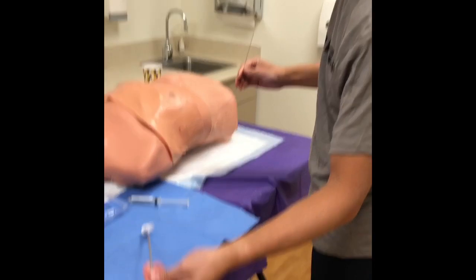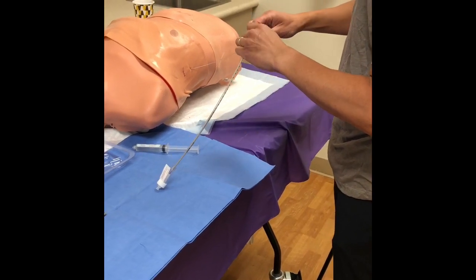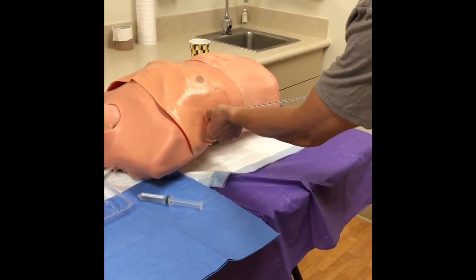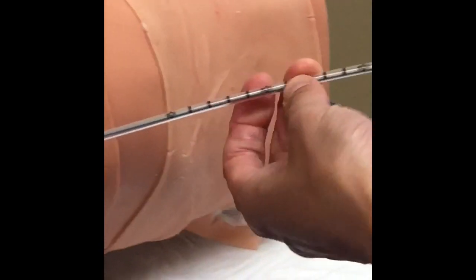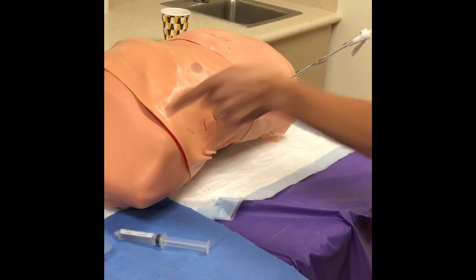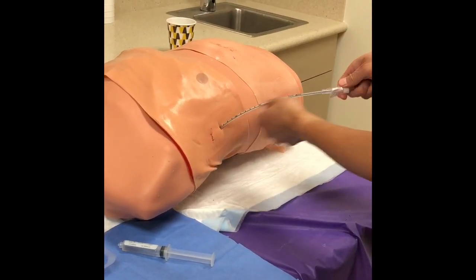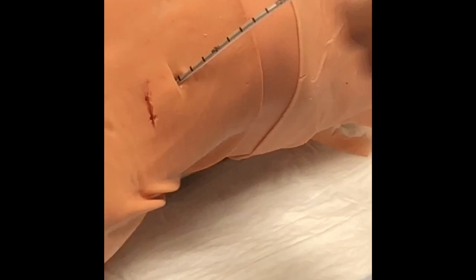This allows you to introduce the tube. This is a 14 French Cook catheter, which is fine for spontaneous pneumothorax as well as pleural effusions — not great for large hemothoraces or trauma. Notice the little fenestrations on the tube and the guide markers. Importantly, measure what you think is the proper depth before you insert the tube, then guide it down and toward the head. At about 13 centimeters depth, you're in a good position.